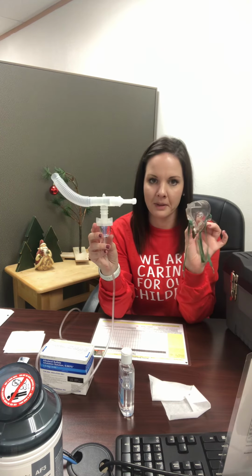And the final medication that I'm going to demonstrate is the inhaler, or the nebulizer. We're doing the nebulizer. So first thing we're going to do is wash our hands. You're going to identify and gather your supplies. Depending on the age of your child, you have 2 different pieces of equipment.